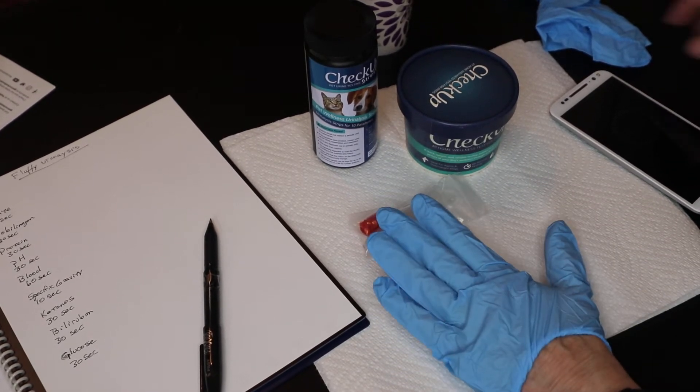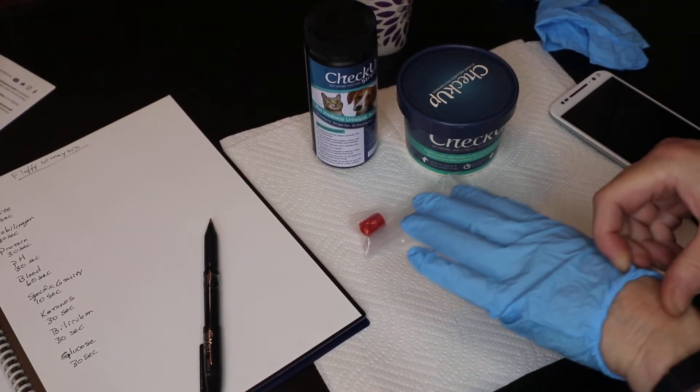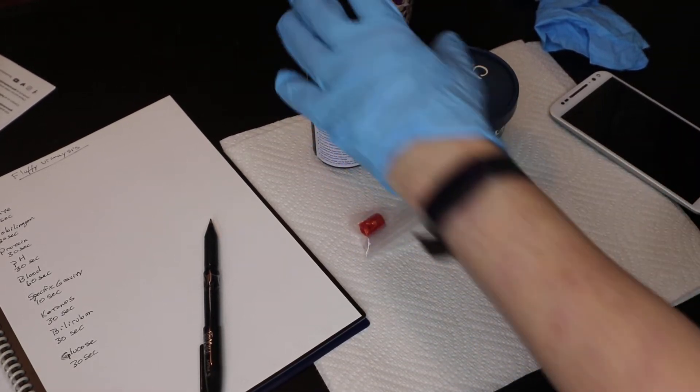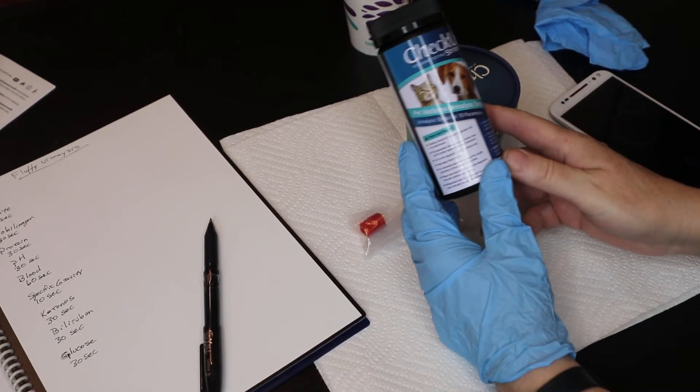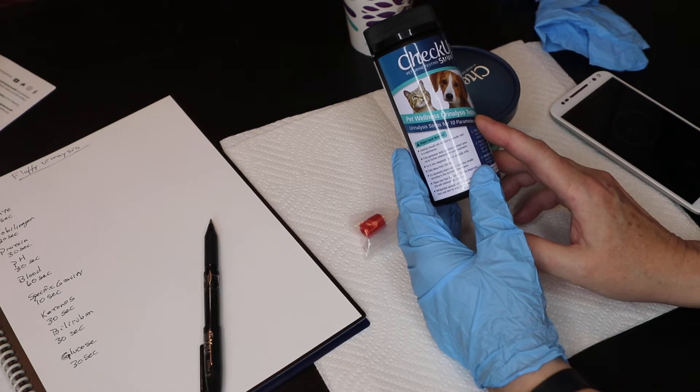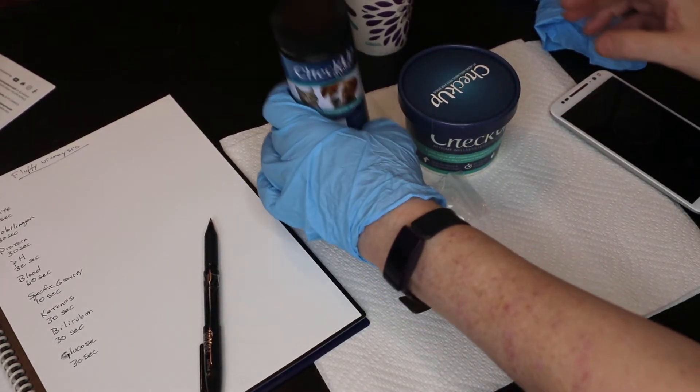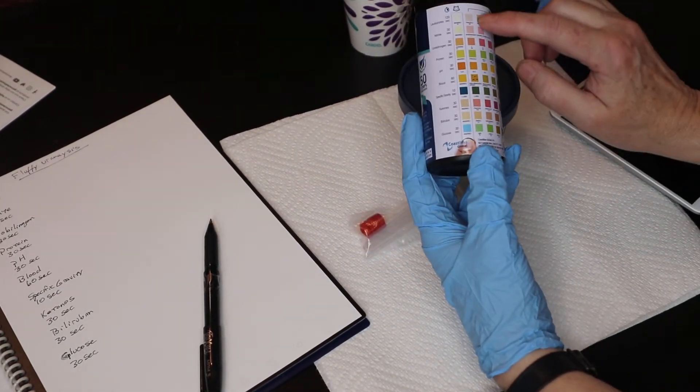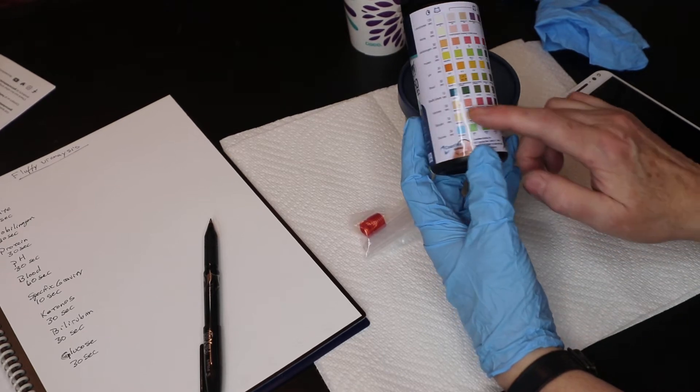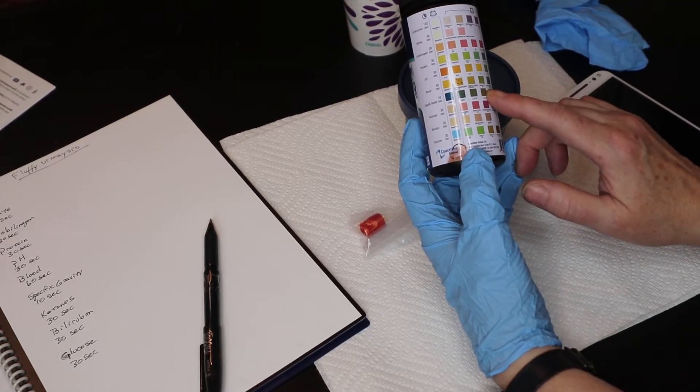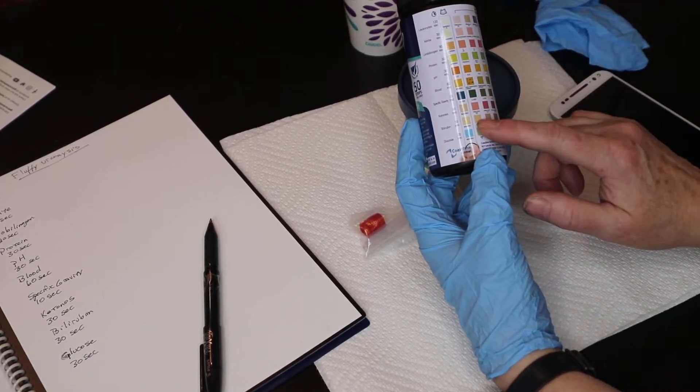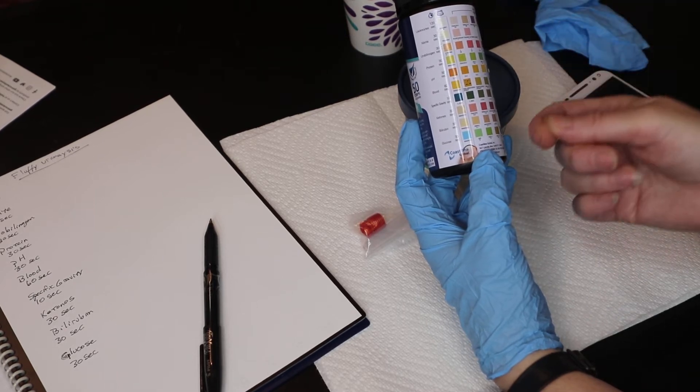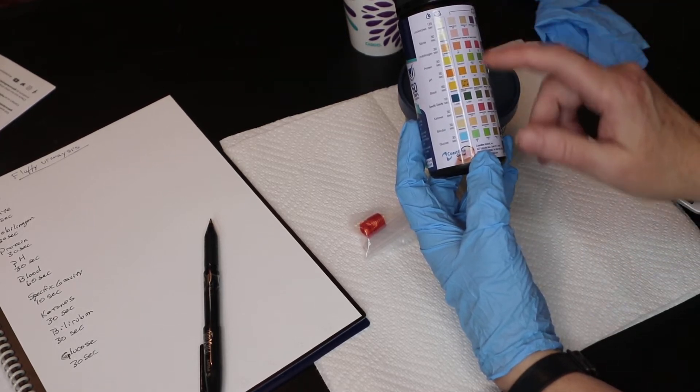Before we begin, let's go over a few things. You want to have your checkup kit, wellness urinalysis test strips, and that on the back has the color coded indices that you will compare your pet's urinalysis strip to.